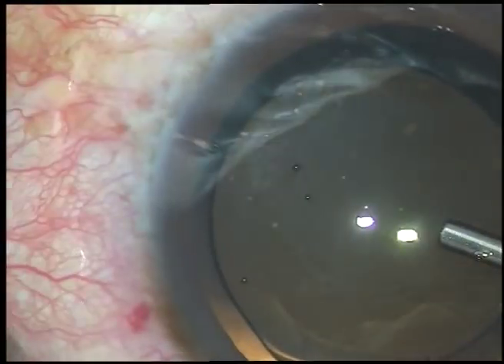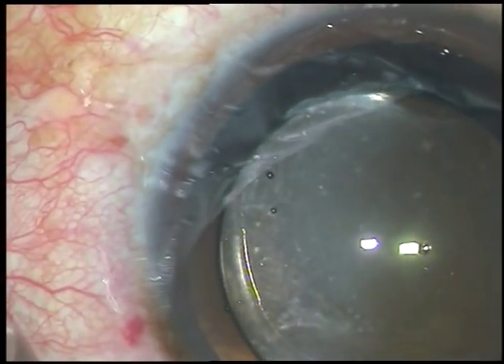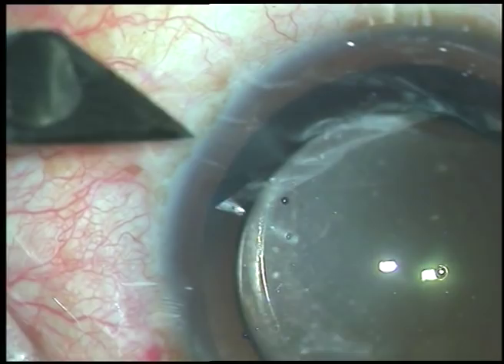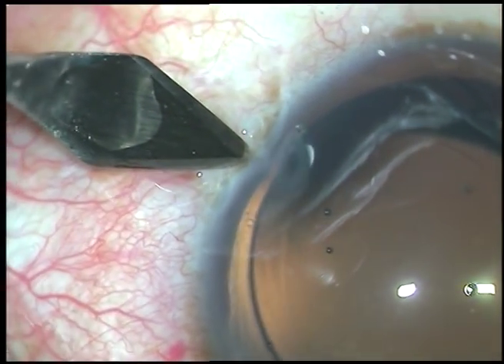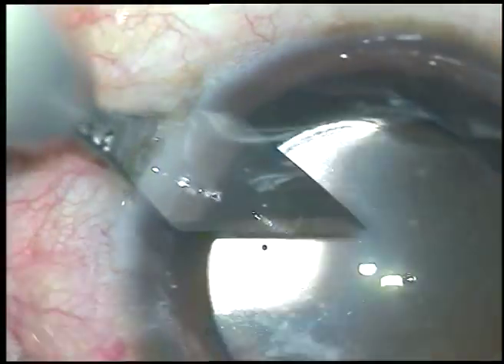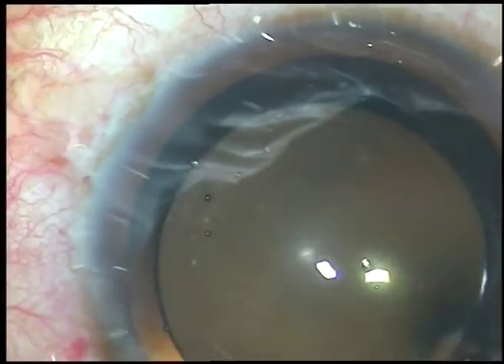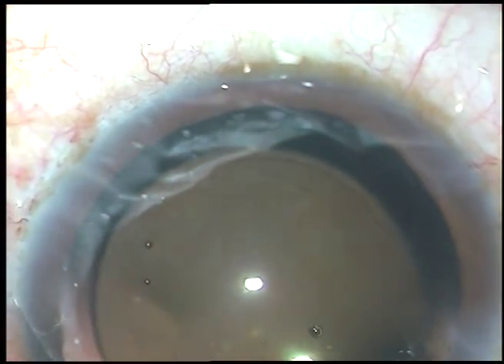Some viscoelastic substance is injected. Now I want to reduce some more of the existing astigmatism, so I take a 2.8 mm keratome and make another 2.8 mm incision at 3 o'clock, exactly opposite the main incision. I hope this will reduce the existing astigmatism to some further extent.